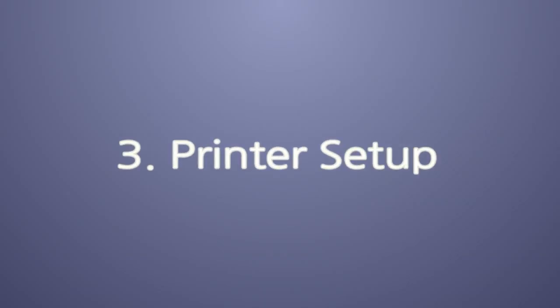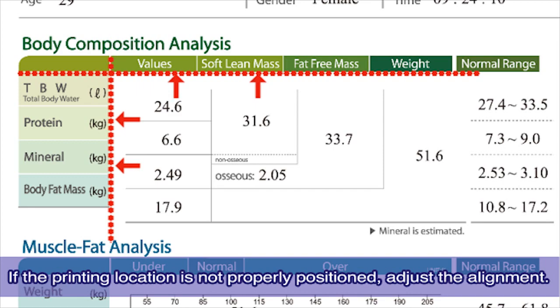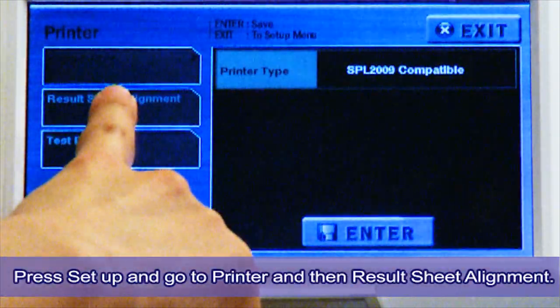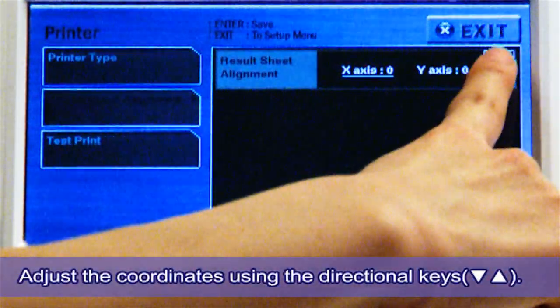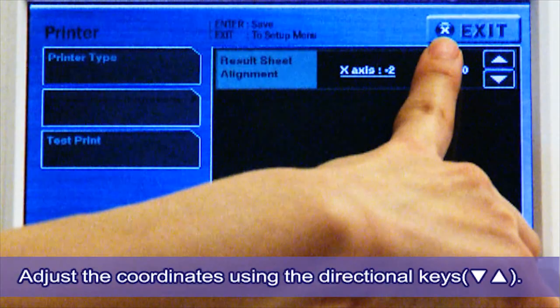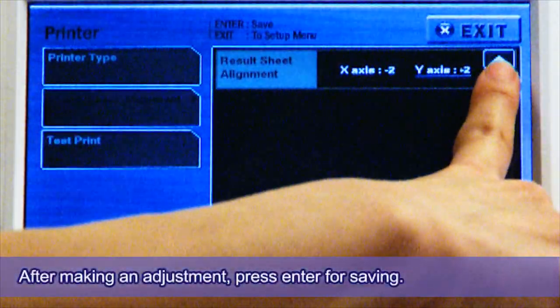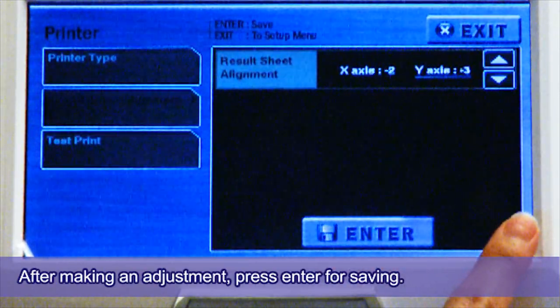Step 3: Printer Setup — Result Sheet Alignment. If the printing location is not properly positioned, adjust the alignment. Press Setup, then Printer, and then Result Sheet Alignment. Adjust the coordinates using the directional keys. After making an adjustment, press Enter for saving. Then go to Test Print to check if the alignment was corrected.